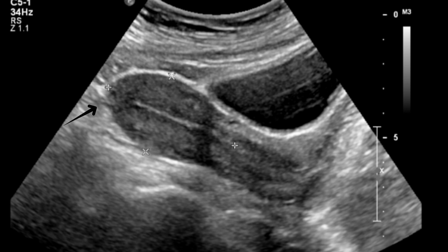Now coming to different parts of the uterus. This upper part is the fundus of the uterus. This is the body of the uterus, and below the body is the cervix. This area is the cervix of the uterus, and going further we can see this area is the area of the vaginal stripe. With this we came to an end of this image. Now moving toward the next image.